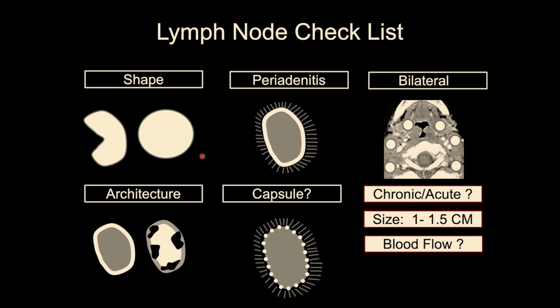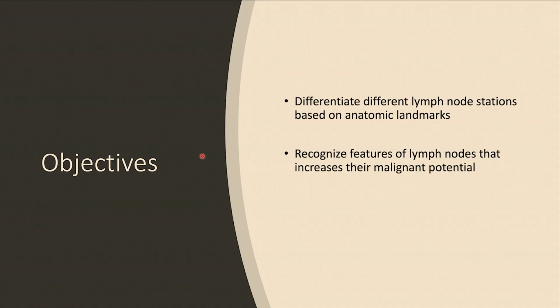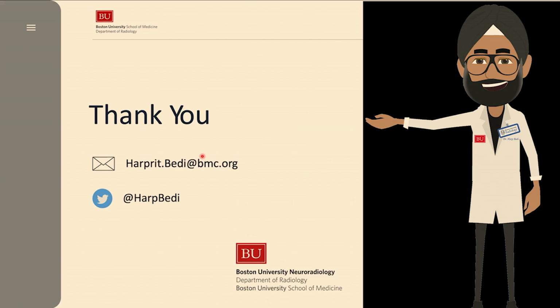Okay? What I was mentioning before, if you have a lymph node based on the plane of your imaging that looks like it could be level 2 or level 3, the phrase we use is junction level 2, level 3. Junction level 3, level 4. That's okay to say. They'll figure it out in the OR. But if it's like, oh, I don't know, I see this muscle and I don't know whether it is, it's okay to use that phrase, junction 2, 3 lymph node. Okay? And again, morphology is king. So I'll end it there. I think we covered all these objectives. So thanks.